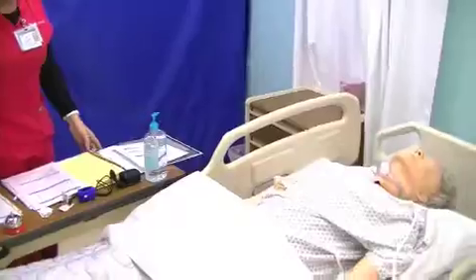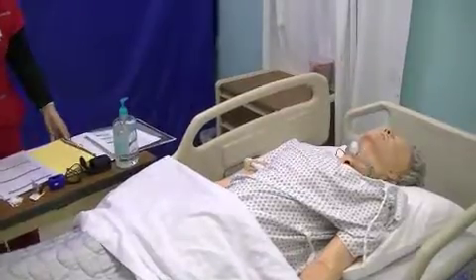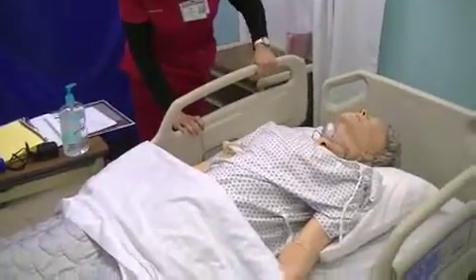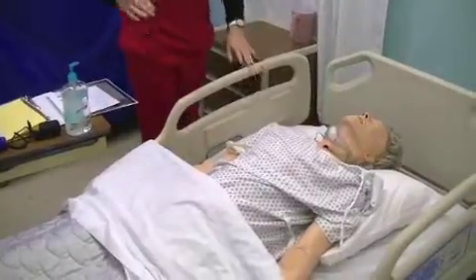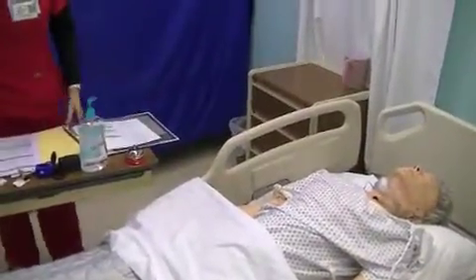Okay, Mr. Pierce, are you having any pain, anxiety, or anything like that, or any shortness of breath? Okay. So now what we're going to do, since we're finished, we're going to put the bed down in low position. Make sure the patient's top 2 rails are up and he's in perfect alignment in bed. We also want to make sure that we put the call light in reach. Mr. Pierce, if you need anything, make sure you push the button, give me a call.